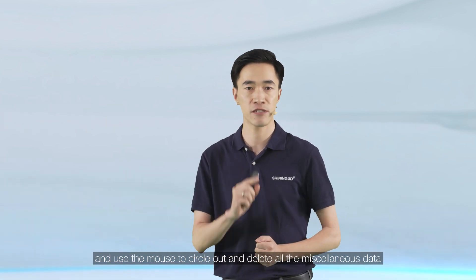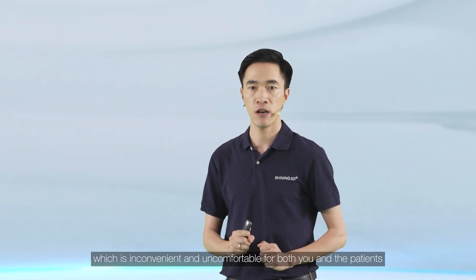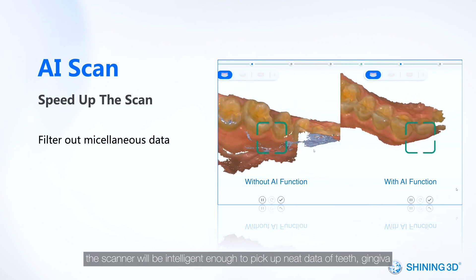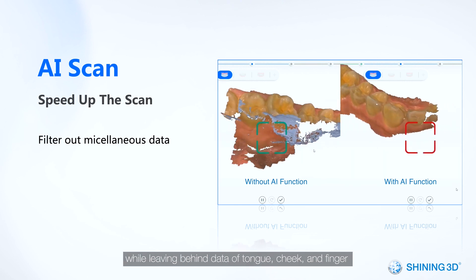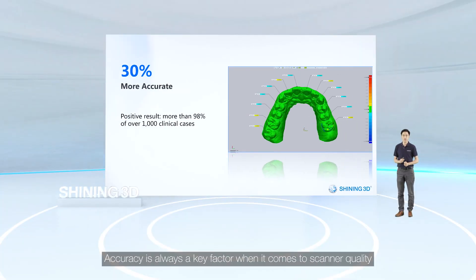This process is inconvenient and uncomfortable for both you and the patients. But once you activate the AI scan function, the scanner will be intelligent enough to pick up neat data of teeth and gingiva while leaving behind data of tongue, cheek, and finger during the whole scanning process.